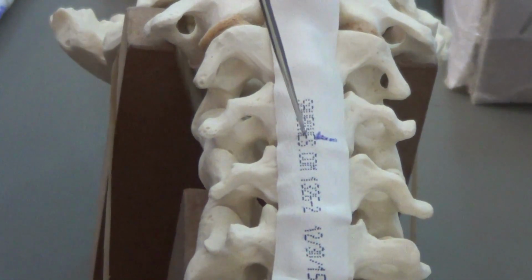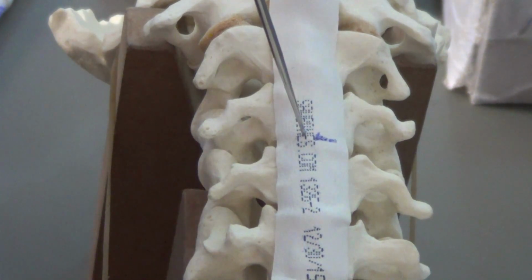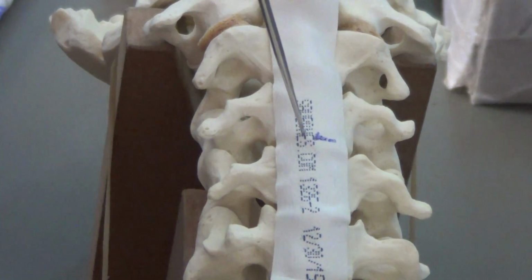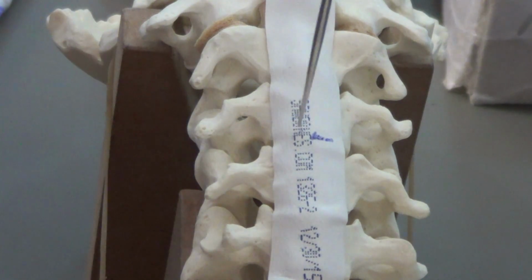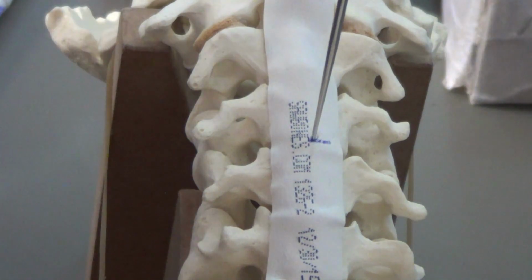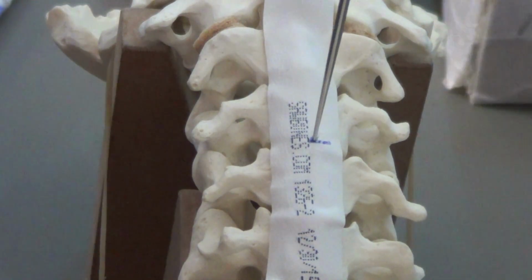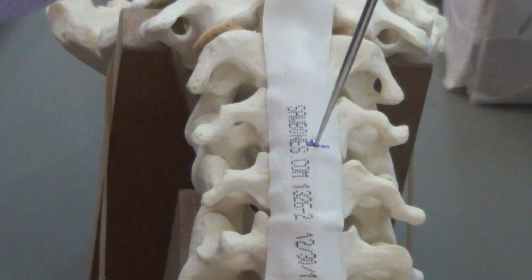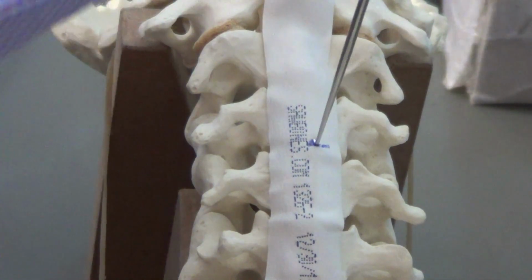Even then, you should be careful. You should not just rely on the pre-operative imaging and on your marks. You should identify that this is the proper disc space. Usually what they do is put a needle in the disc that is to be excised and then confirm it with a lateral x-ray. Once you have identified the disc, definitely you have to do imaging, a lateral x-ray, and confirm that this is the disc.